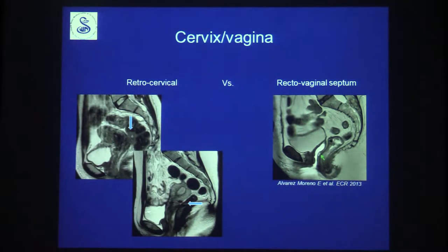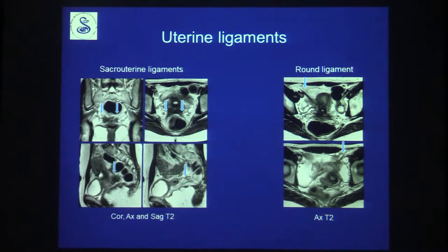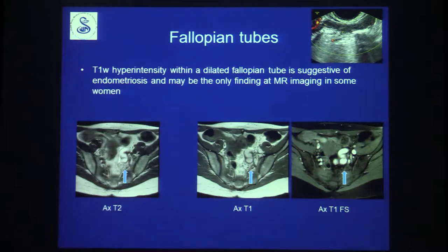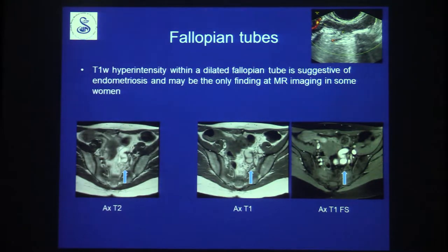Sacro-uterine ligaments can be seen on both sides, one often more involved than the other. Round ligaments are frequently overlooked — always look for thickening of these structures. Fallopian tube involvement — a dilated tube with blood content — can be the only sign of endometriosis, seen on T1, T2, and corresponding ultrasound images.